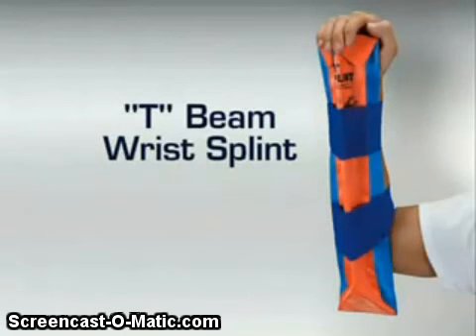The T-Beam Wrist Splint. Use the T-Beam Wrist Splint when extra strength is needed.